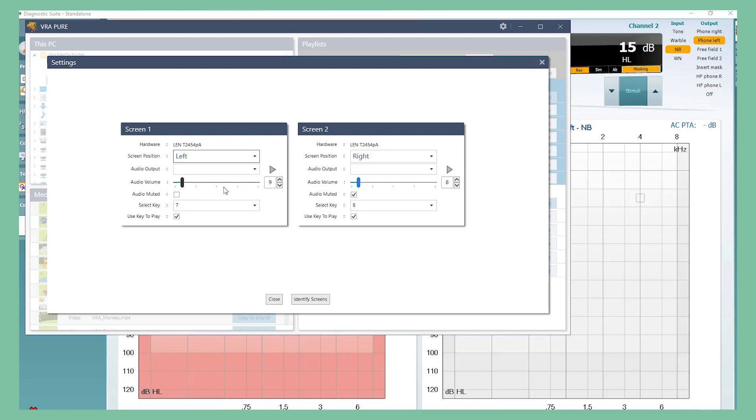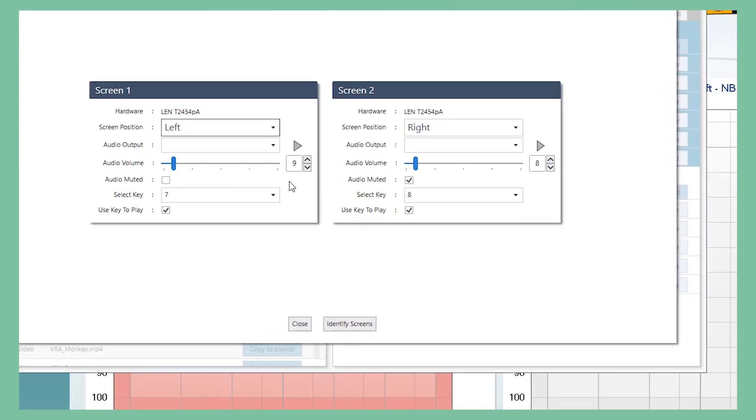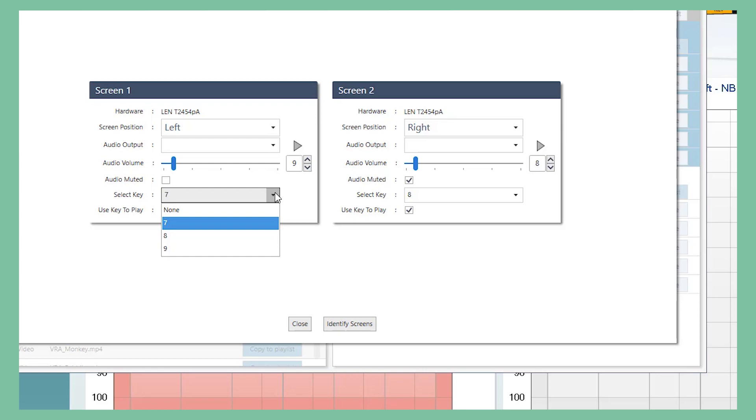We have made it possible to select a keystroke on the keyboard where you press end, tap, and seven, eight, or nine. When you are using the keyboard to do audiometry, you can activate the screen without moving your hands from the keyboard.